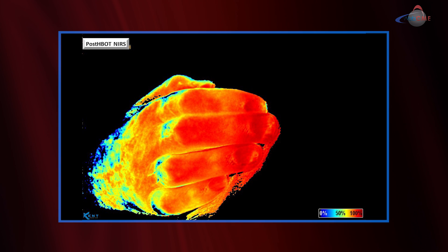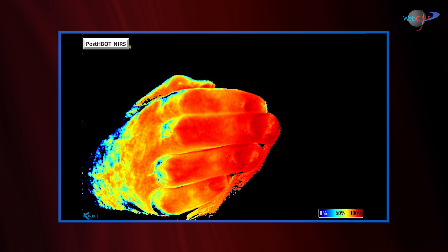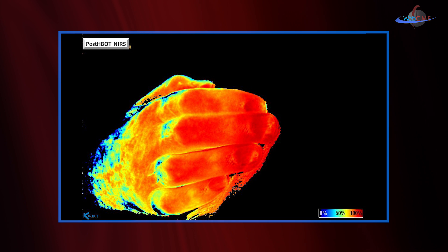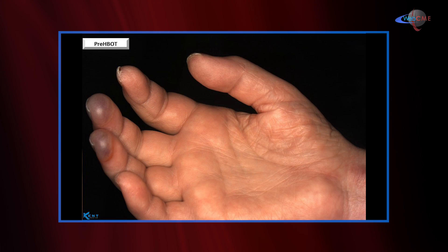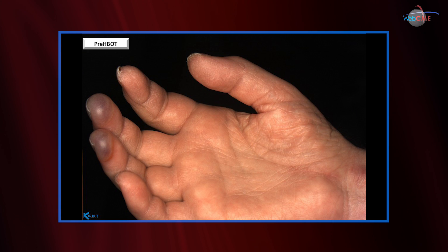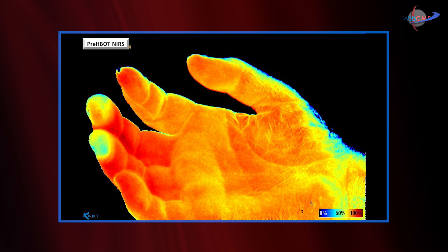So we again imaged this tissue with near-infrared spectroscopy, and now look at the robust oxygenation of that tissue — especially where we had previously seen low oxygen values in the tip of the third and fourth fingers. This is another view looking from a palmar approach, pre-hyperbaric oxygen therapy.